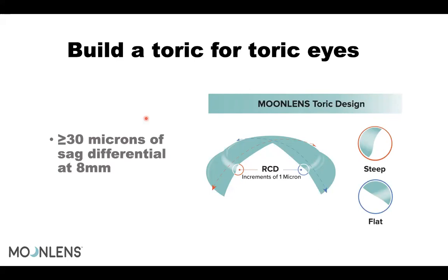So imagine a -7 compared to a -1. This is important to know because of what we should tell our patients to expect, how long it's going to take.